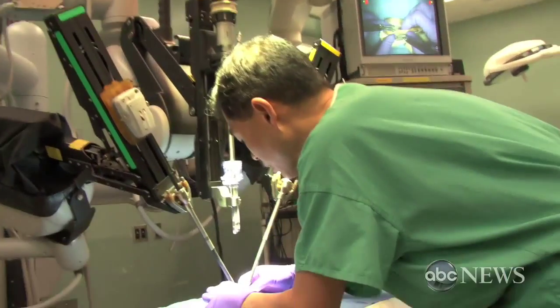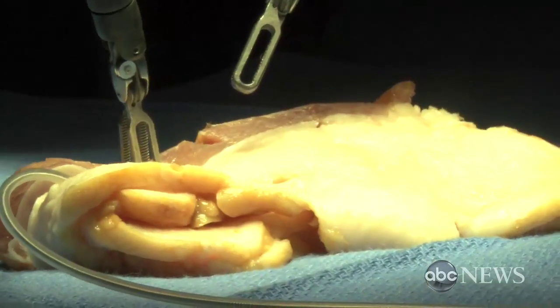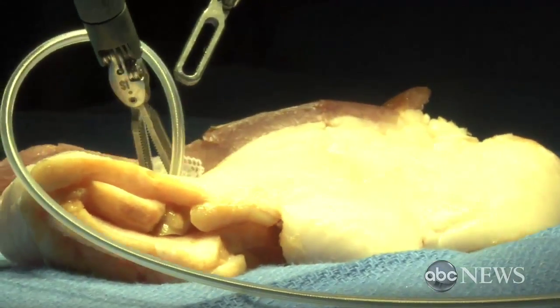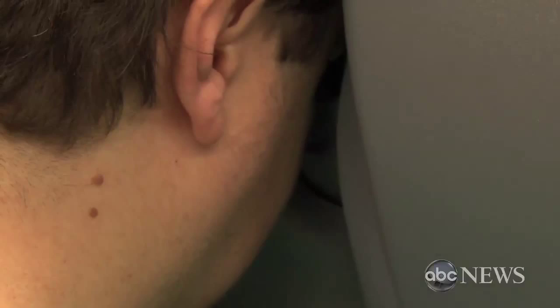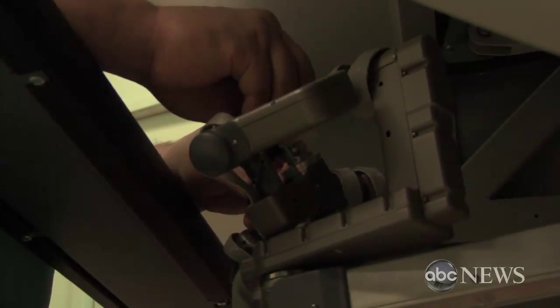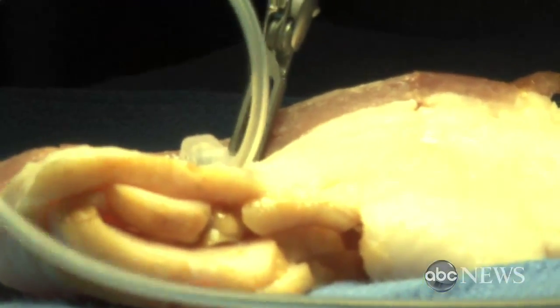Okay, let me start over. Enough to press down and you can see the indentation — that's much better. So you got one turn there, about a half turn there. Can't go any further? Stop. Stabilize it with your right hand. That's it. Perfect. Throw it out.